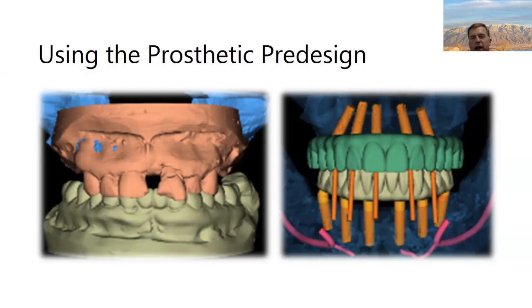With static guidance, like in sequence, when you see the plan, the implants are planned based on that prosthetic tooth design to ideally support them and to plan what, like in this case, what MUAs you might need. So the prosthetic pre-design not only becomes the template for your surgery, it also becomes, and we'll talk about this, the actual provisional that your patient will wear.